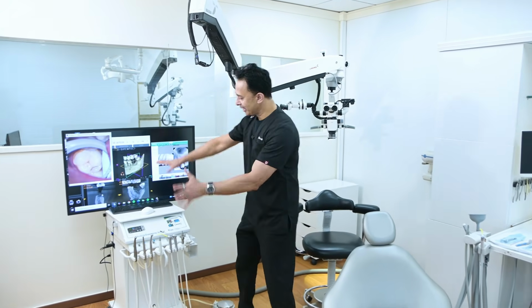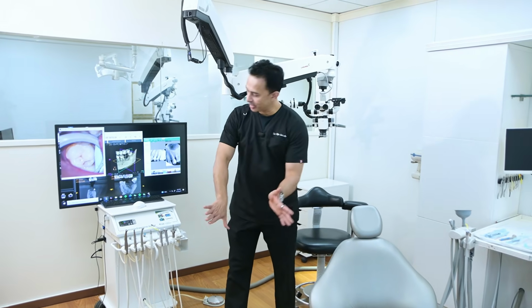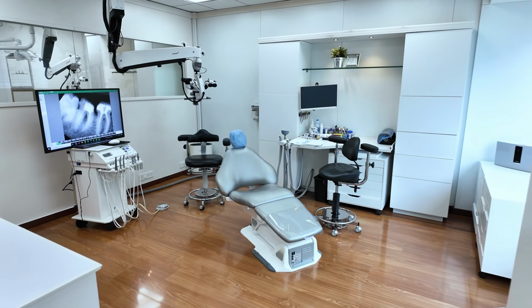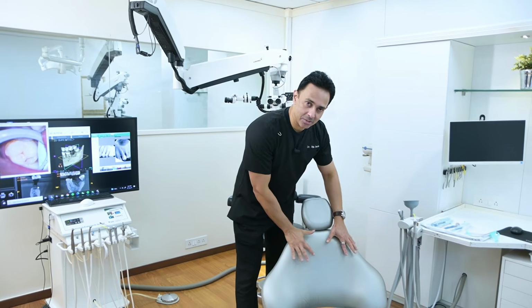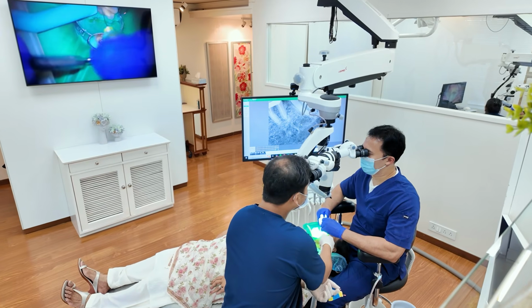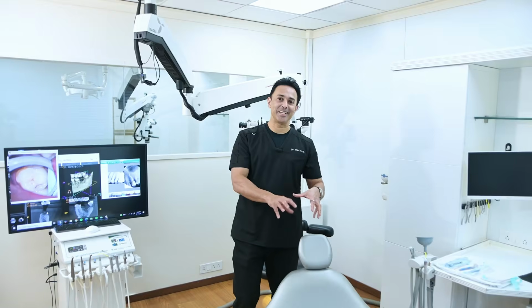So this cart and all the attachments that you have is independent of the chair, again adding to the roominess, because when the patient walks in, you have the freedom to move the cart out of the way like you see here. So the patient walks in to a chair completely open on all sides. So that's the initial impression the patient gets, and that helps a lot in reducing anxiety. Once the patient sits in the chair, then yes, you can bring in the cart from the side and move it in place. But even when you are working, the patient is never boxed in the way they are in a typical arm-based setup. So that's a huge difference in this operatory compared to a typical dental operatory.